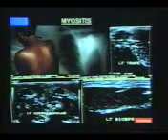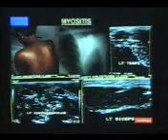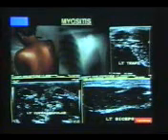There are small areas showing micro abscesses over here. These are the micro abscesses. Few small abscesses are seen. These are again in the suprascapular region. This is the trapezius muscle, and this is a diffuse myositis involving the shoulder muscles like trapezius, subscapularis, biceps, and small micro abscesses, diffuse myositis.